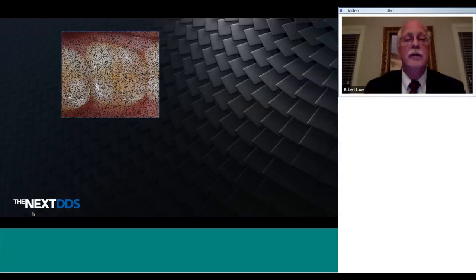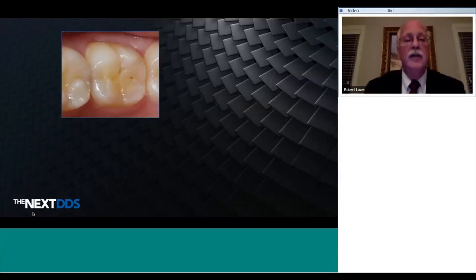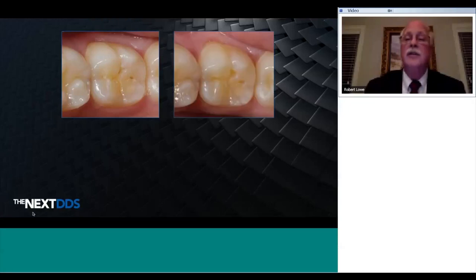What about that? Is it decay? Is it a stain? Do you treat? Do you not treat? Well, we're going to talk about early diagnosis. We're going to talk about other diagnostic tools, caries fluorescence, using specialized cameras with filters that allow us to detect early bacterial stain and differentiate stain from bacteria or active decay. And then we can remove that area only and restore, instead of making this big preparation that we were taught by, God rest his soul, Dr. Black.